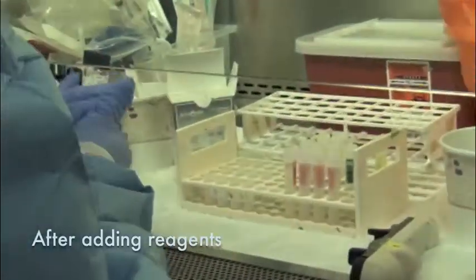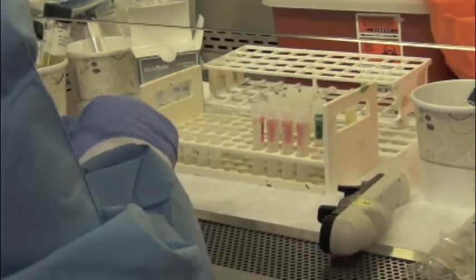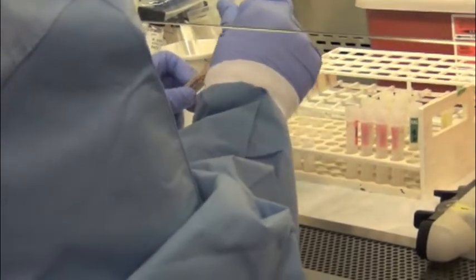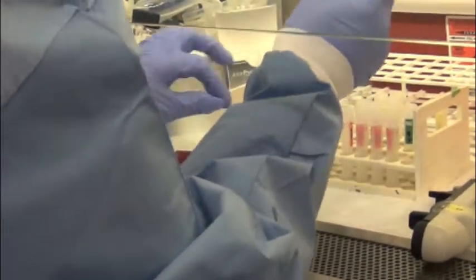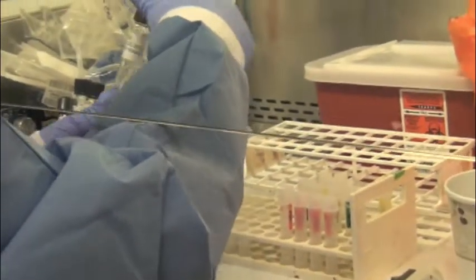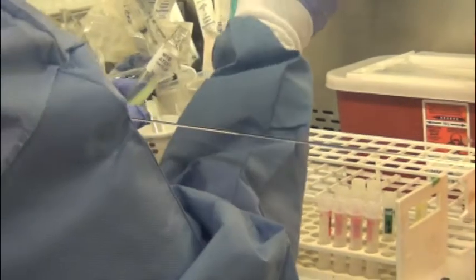Alright, now we're going to add our controls. For our TB control, our first tube will be MTB.